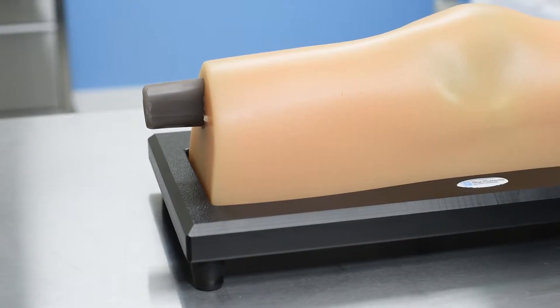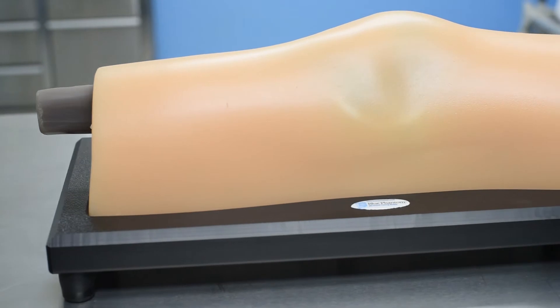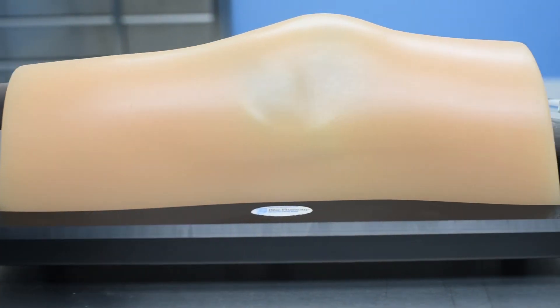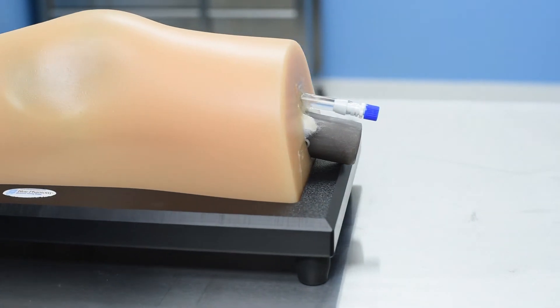Adoption of MSK ultrasound-guided knee injection has increased dramatically in recent years. Studies have shown that ultrasound-guided knee injections are sixty percent more effective than blind injections administered into the knee.